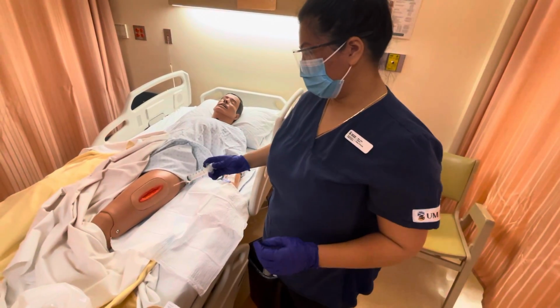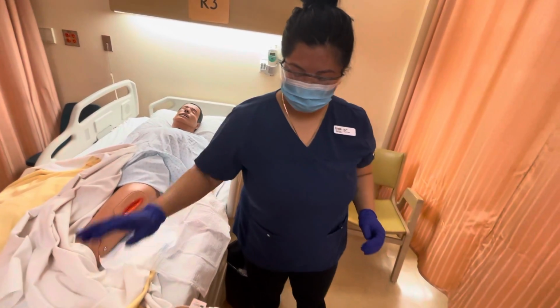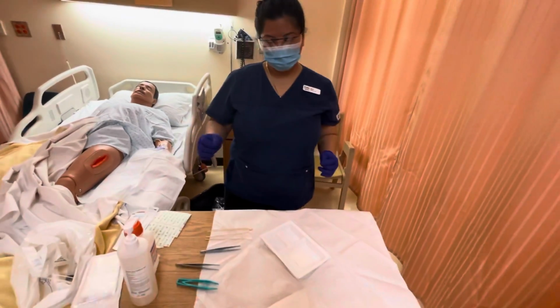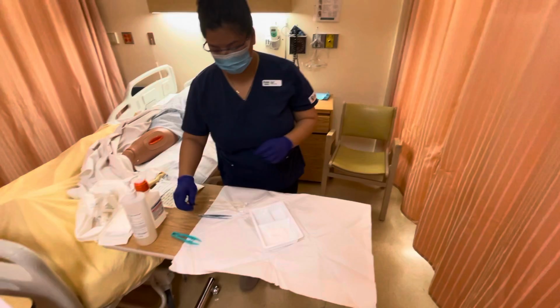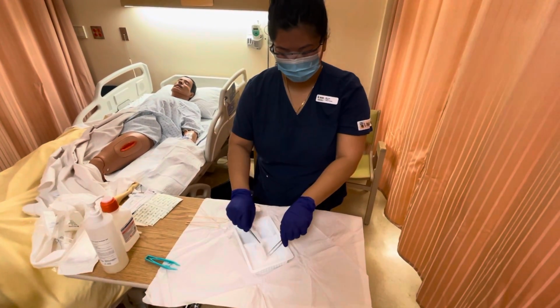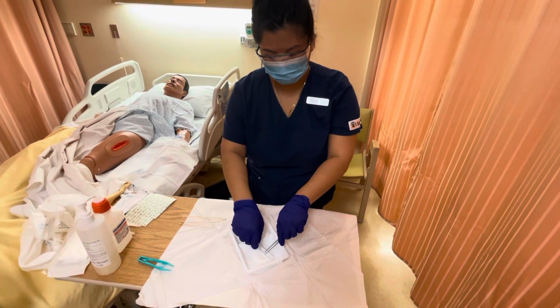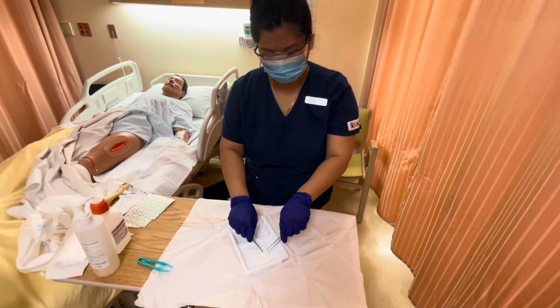And then again, I'm going to be documenting. So we'll just toss that into the garbage, and then we're going to dry the peri wound. So we're going to form a rosette using our 2x2 gauze, and then dry the wound using the one swipe or wipe method.